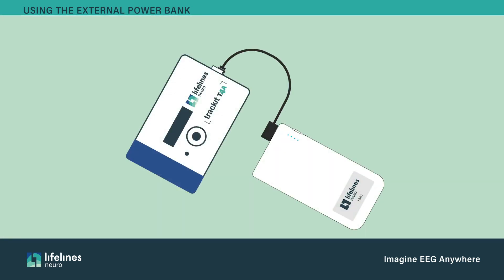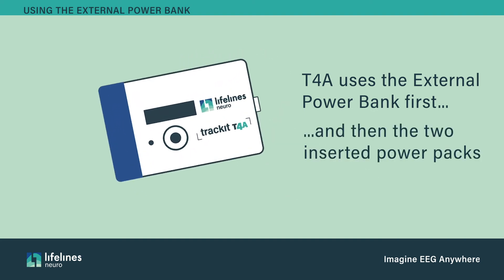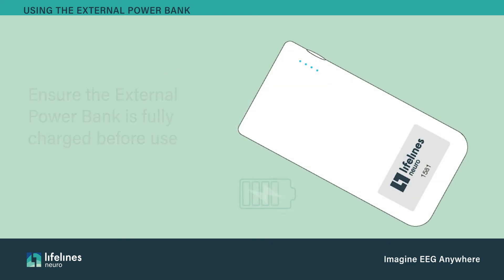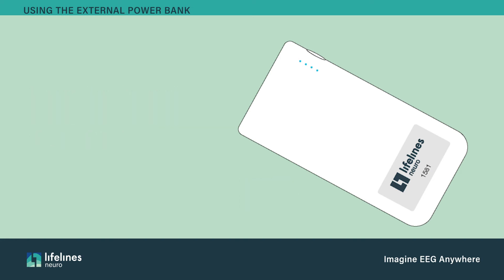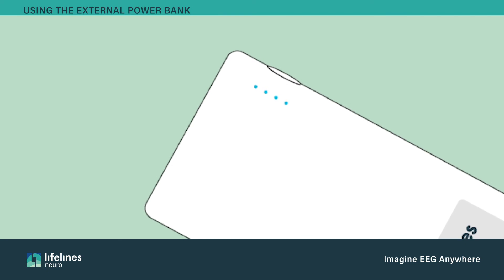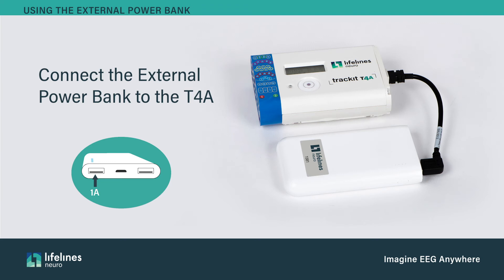When connected, the T4A will utilize the power first from the external power bank, then use the power from the inserted T4A batteries. Ensure the external power bank is fully charged with a standard USB charger — this charger is not supplied by Lifelines Neuro. The power bank is fully charged when all four LEDs are illuminated. Connect the external power bank to the T4A using the external power bank cable, using the USB connection marked 1 amp. The power bank will turn on automatically when the T4A is on.